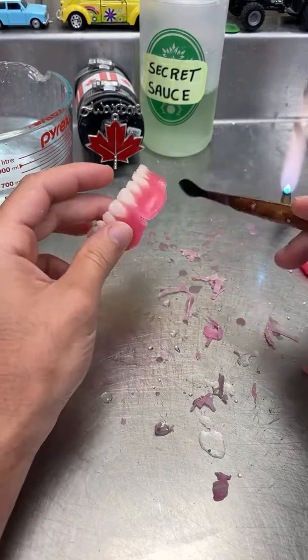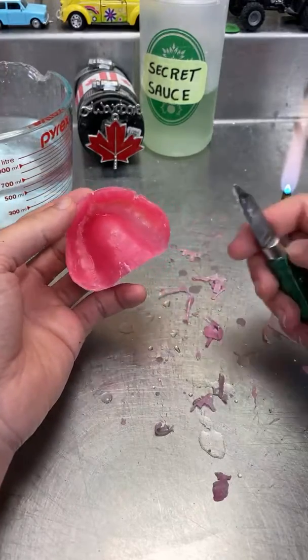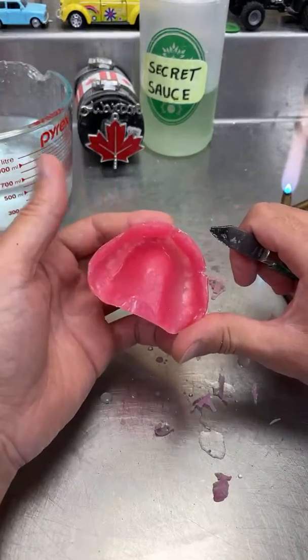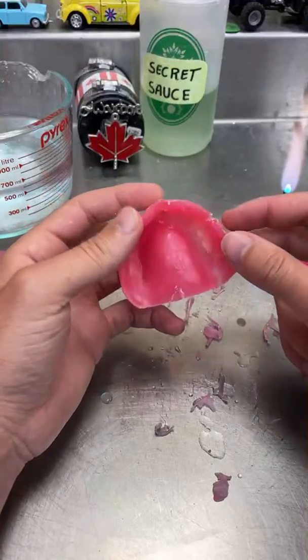Okay, so I like this way here because you don't press. Some people will use this and will be cleaning the edges. Don't ever do that, because with that thumb you're pressing, you will distort. You will push that to the inside or change the dimensions.